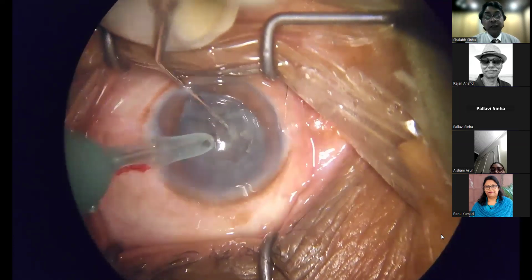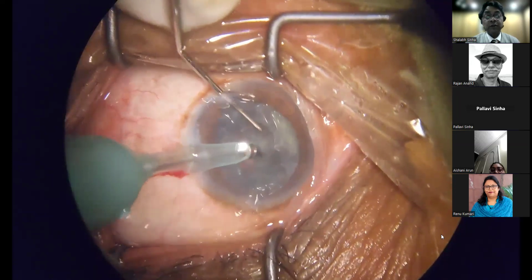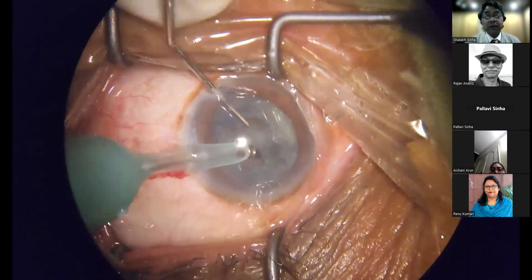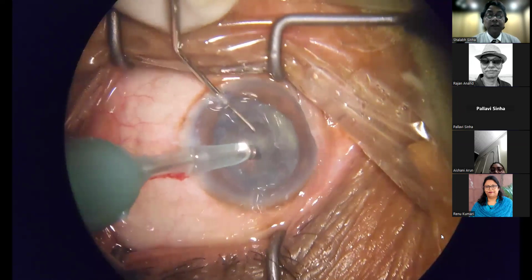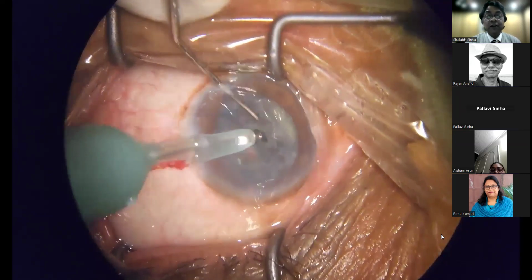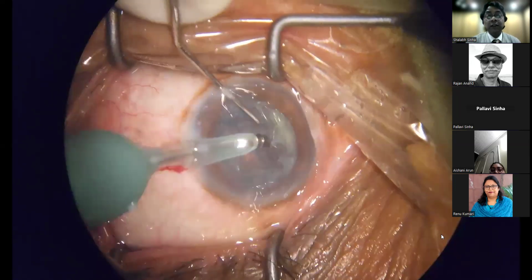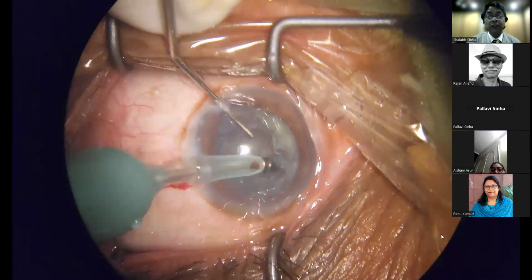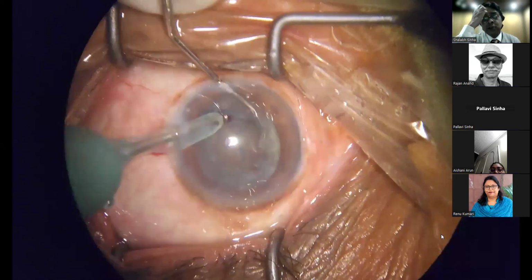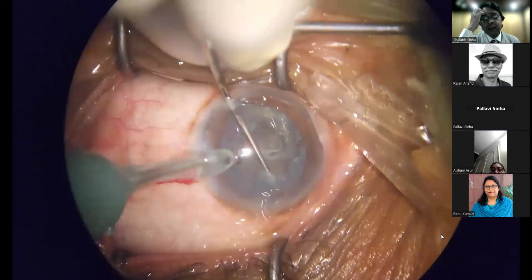So it was cheese wiring. So now I've tried to remove the bridge that was there, shifting the parameters a little bit so that I can hold the nucleus. So that's why you saw me waiting for my assistant to change the parameters.